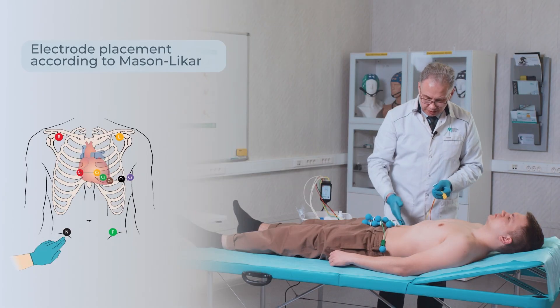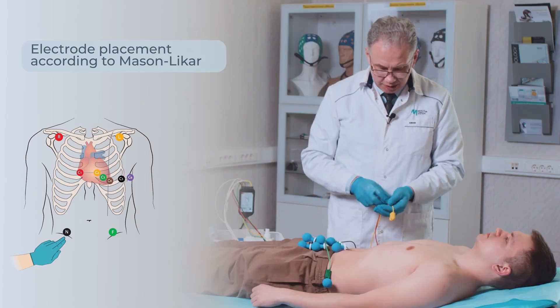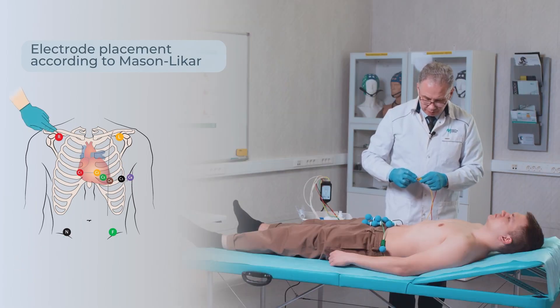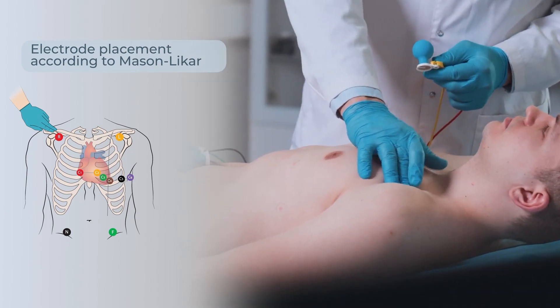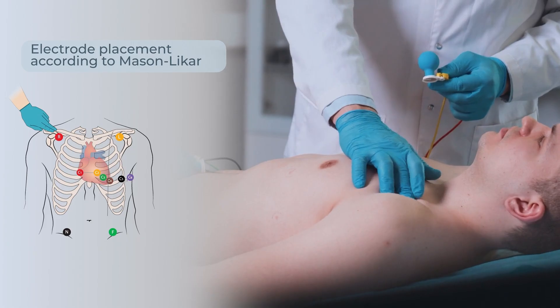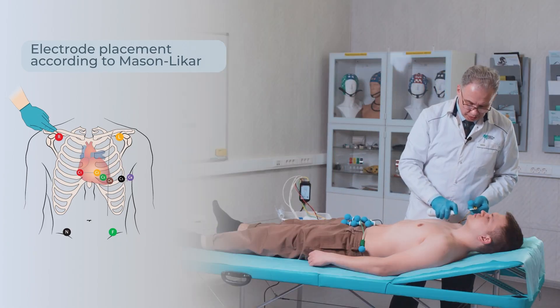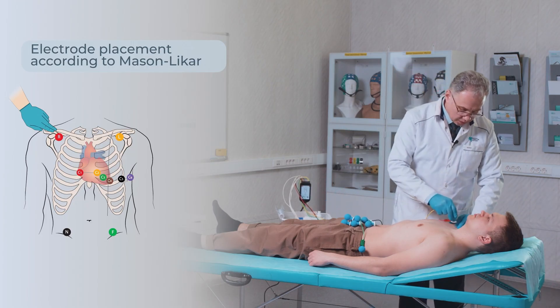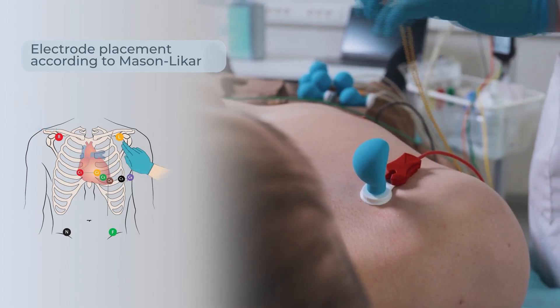The green electrode is on the left, the black electrode on the right, just as in a standard recording. We move the electrodes from the lower third of the forearm under the clavicle into the fossa. It is easy to apply spray to the skin here. The red is on the right, the yellow on the left.